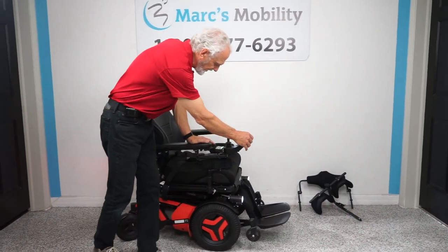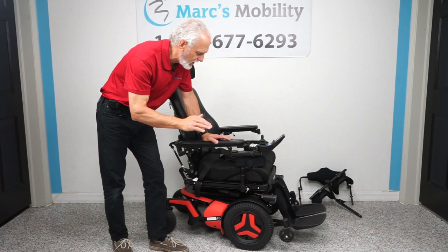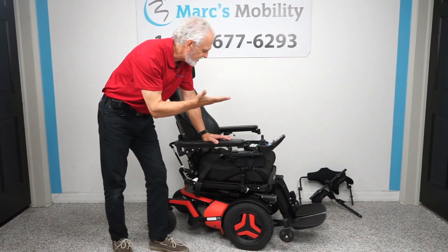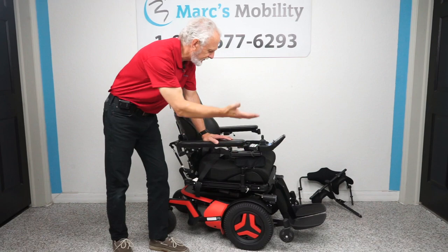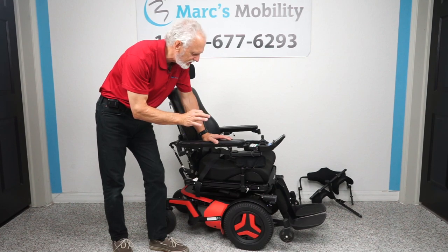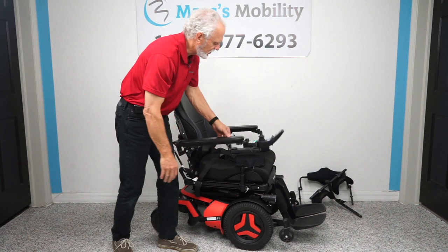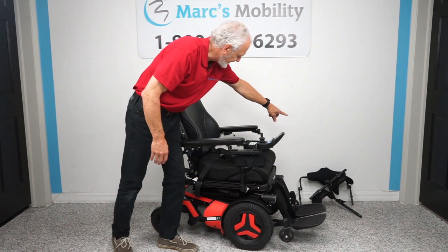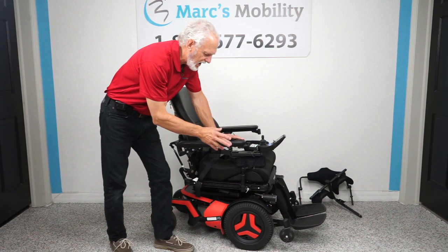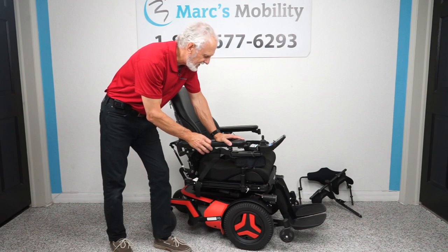We have the Permobil F5 VS vertical standing with 27 miles, used about a month — literally brand new. It has the standing feature, 14-inch seat lift, electric tilt, electric recline, electric feet, interior tilt, and feet that go up and down — seven electrical functions total. It has headlights, swing-away joystick, lateral knee pads, knee pad and chest guard accessories, adjustable headrest, and factory lights. This is top-of-the-line, the latest model from Permobil — ready to go.